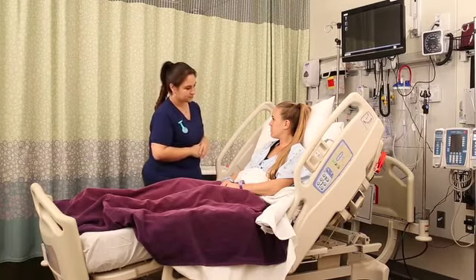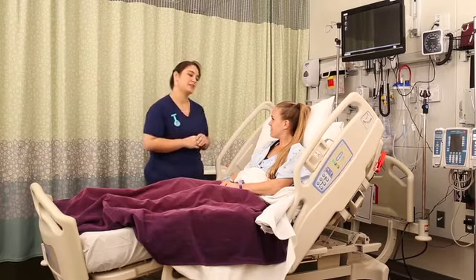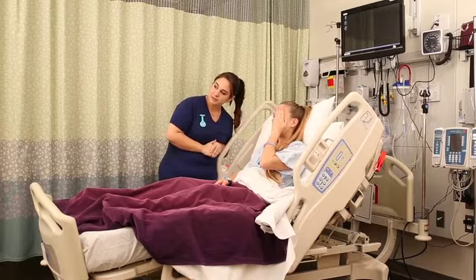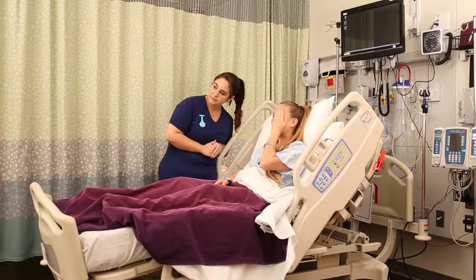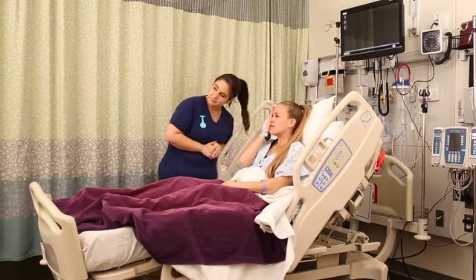Now we can check vision and pupil function. So you can use a Snellen chart or other visual acuity chart, place it about 20 feet away from the patient, have them close one eye at a time and read the chart, just testing for visual acuity. If you don't have a Snellen chart, you could also have them read a sign on the wall across from the bed.